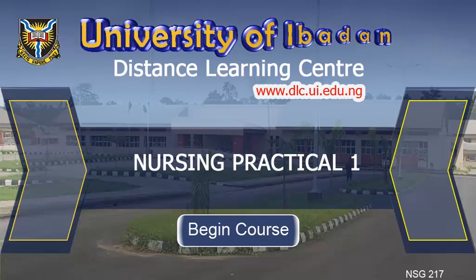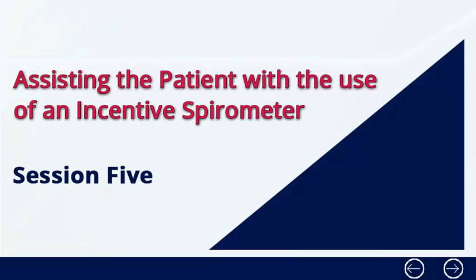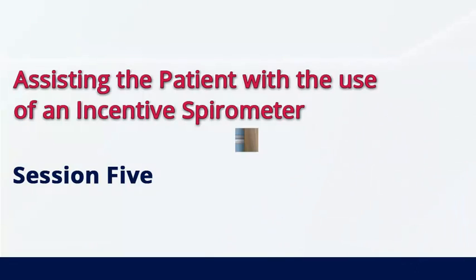Welcome to NSG 217 Study Session 5, Assisting the Patient with the Use of an Incentive Spirometer.